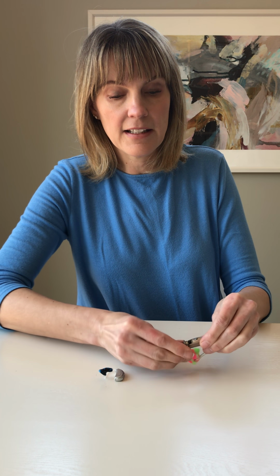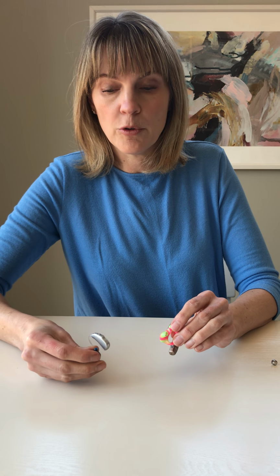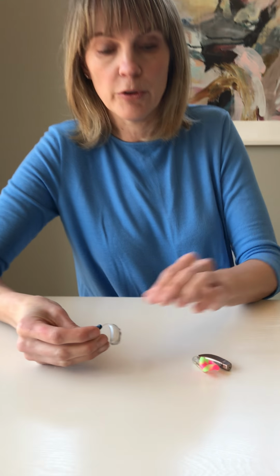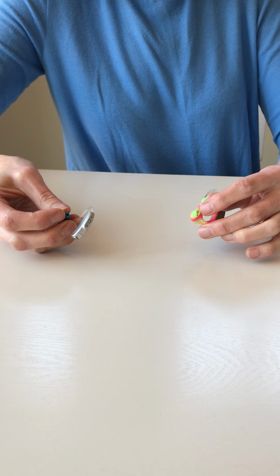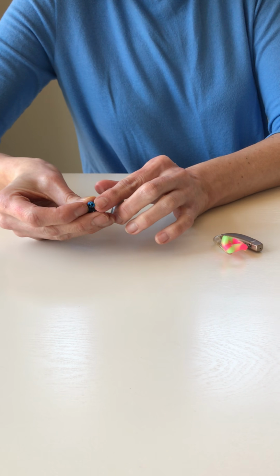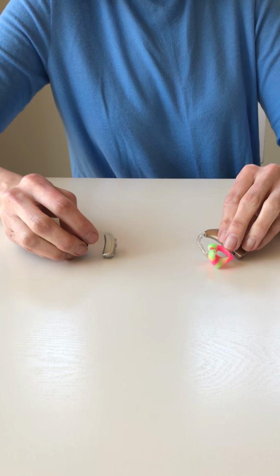taking a look at the next part of the hearing aid that may not be working, and that part is probably going to be the ear mold. It might be a dome if you have a dome on the end of a slim tube hearing aid, or again might be an ear mold. But either way, you're going to look at the piece of the hearing aid that goes into the ear, and what you're looking for is debris that might be blocking the sound port, that little hole where sound comes out and directs it into your child's ear. That is very tiny, as you can see, and is very easily plugged with wax or debris.